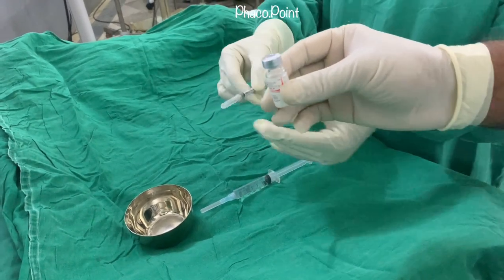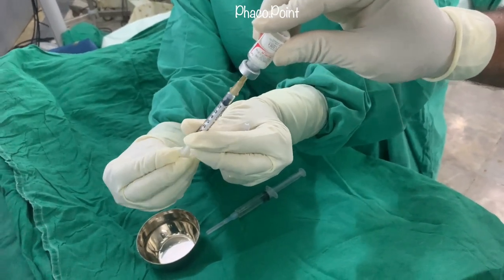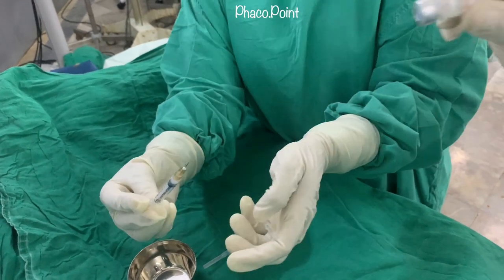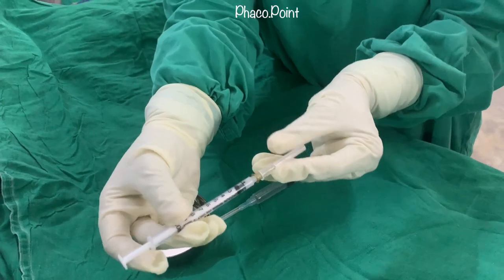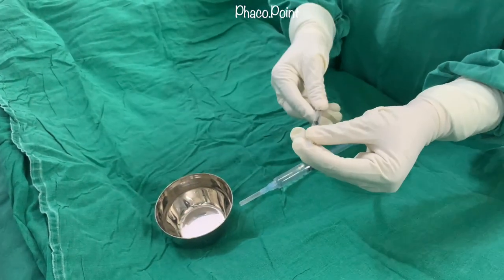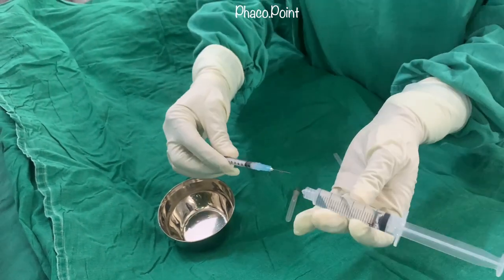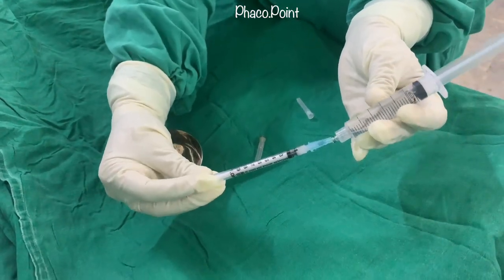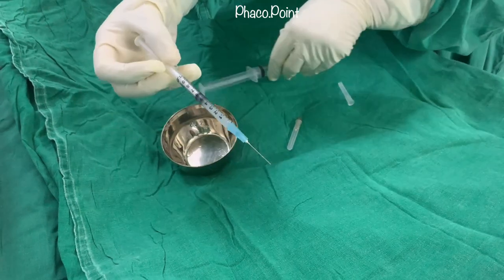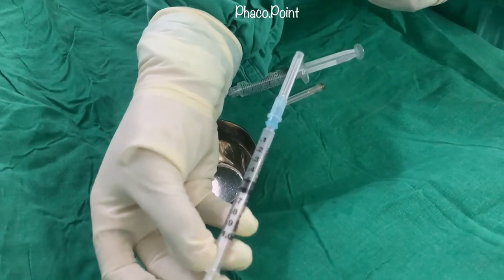0.1 ml of triamcinolone acetonide containing 4 mg of the drug is aspirated into a tuberculin syringe. This 0.1 ml is now further diluted 1 in 5 using either ringer lactate or BSS. This diluted solution is now ready for its intracameral use.